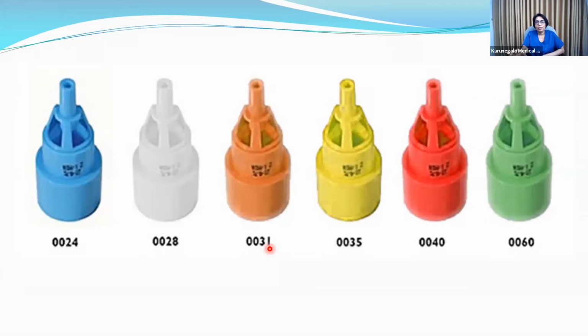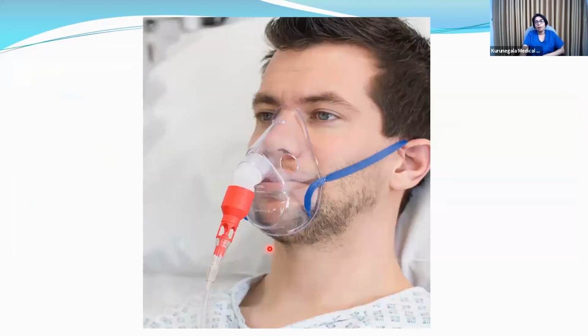These are the Venturi devices. As I already told you, these are not universally color-coded. The FiO2 the particular Venturi device delivers is marked there with the flow rate that we should provide. And this is how it appears when it is applied to a patient. Now, with this mask, you do not have to have a tight fitting face mask, so the patient is more comfortable. No rebreathing at all.